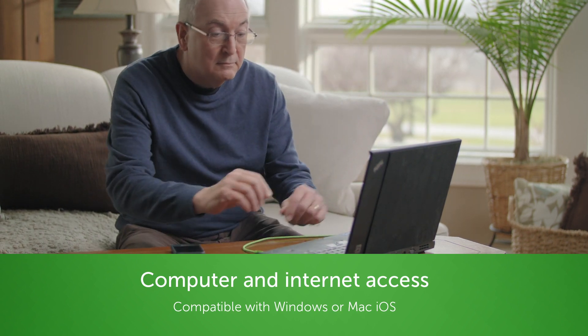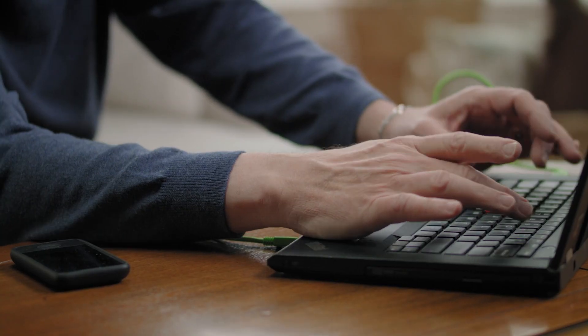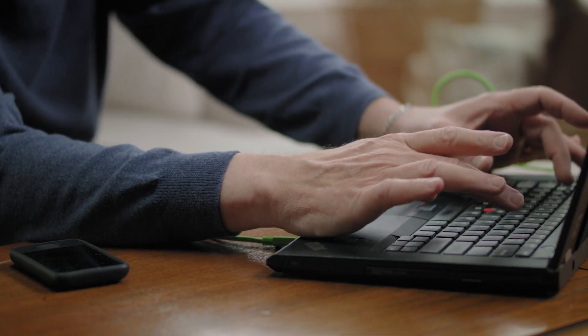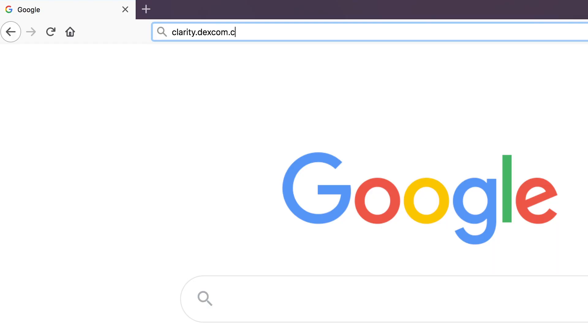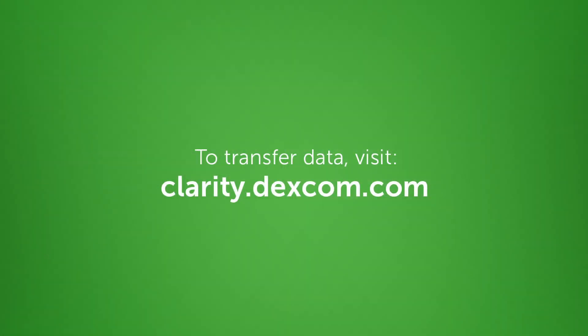All you'll need is a personal computer and internet connection to start the process. Before we start, if you want to keep all the data currently on your receiver, just transfer it from the receiver to Clarity before installing the software, otherwise the data will be erased. To do this, visit clarity.dexcom.com.